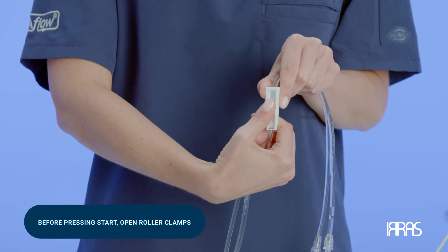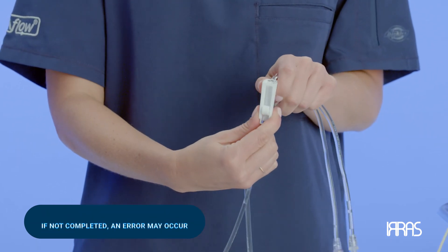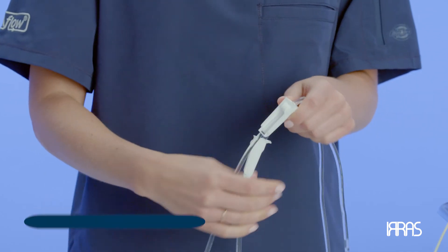Before pressing start, make sure all the roller clamps are open. If this step is not performed, a system error may occur and delay treatment.